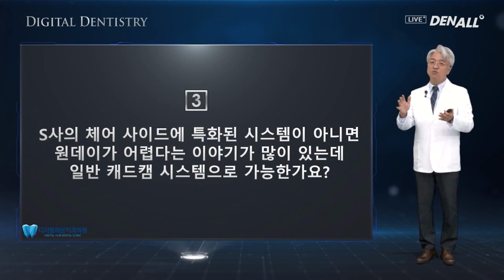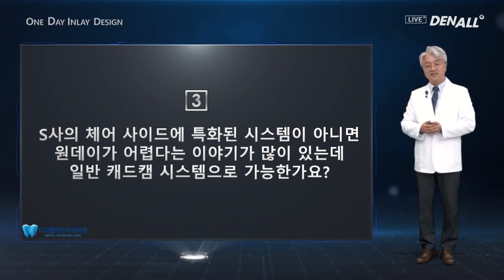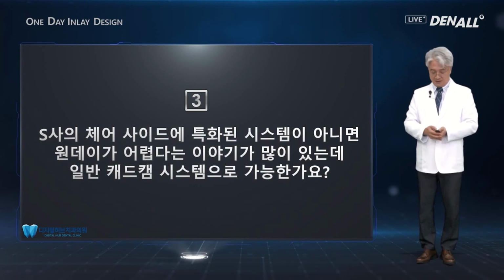So a lot of constraints have now been overcome, and all of these are now available in your clinical setting. So without this customized system, with the general CAD/CAM system, I believe the one-day approach is now possible.